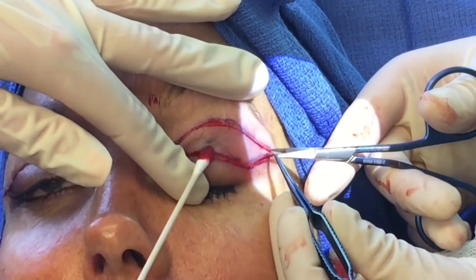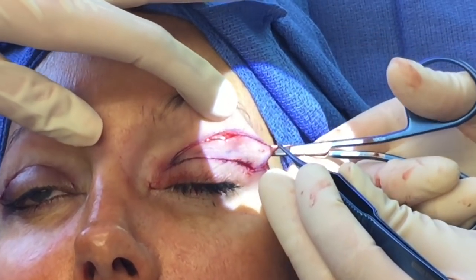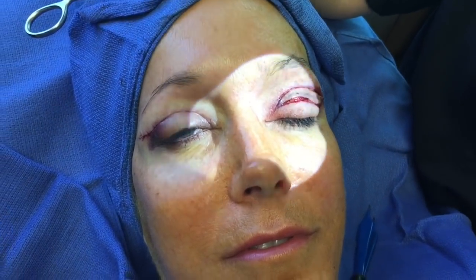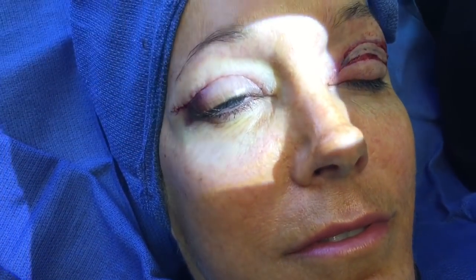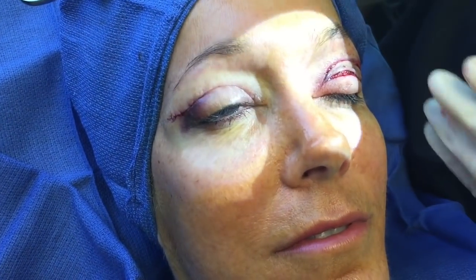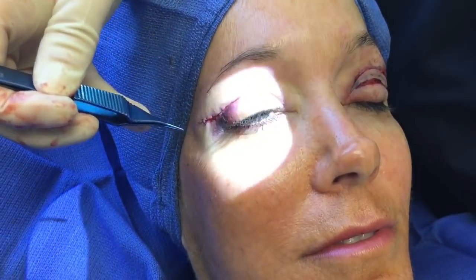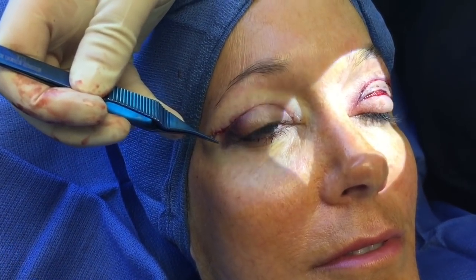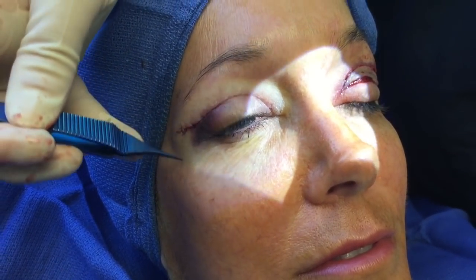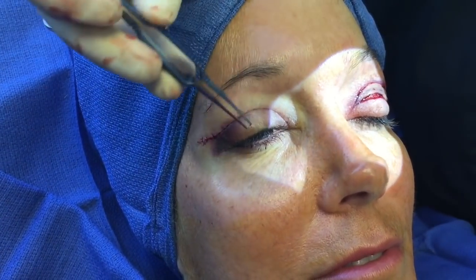Right now I'm removing the skin from off the muscle. The right side has been completed — the incision looks good, it's a nice thin line with very minimal sutures, and all the suturing is done underneath the skin. One of the nice things about the way I do this incision is I like to curve the incision up towards the end, which really lifts up that extra skin on the outer corner and gives a much more open look to the eye. This also prevents the downturn look that people fear when seeing some blepharoplasty results.